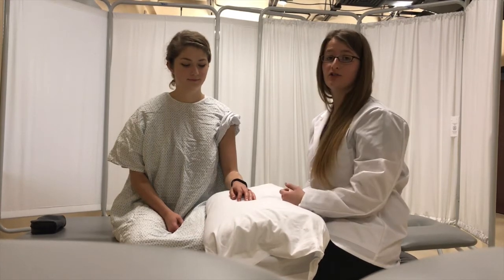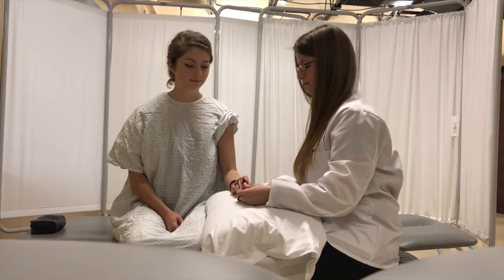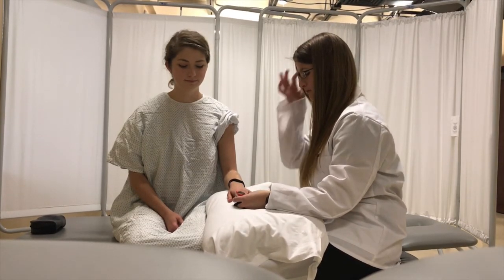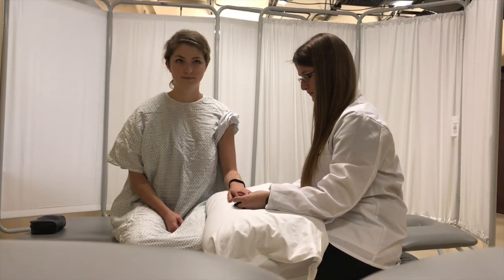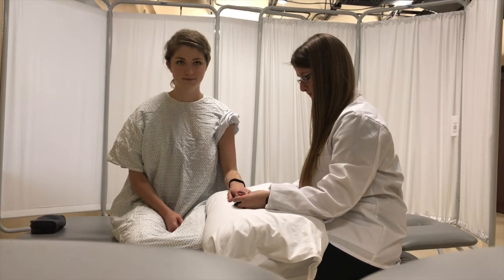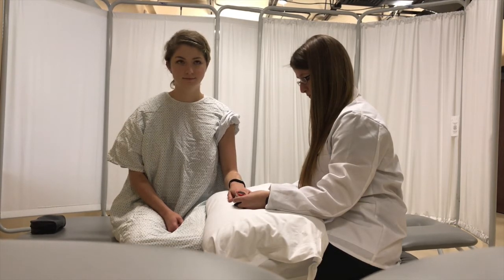And now for her oxygen saturation. Oxygen levels can be taken either on the finger or earlobe. Patients with cold hands, poor circulation, or nail polish may need an earlobe reading. An oxygen level of 95% or higher is normal, and below 90% is a concern. If your patient presents with an oxygen level below 90%, action needs to be taken.